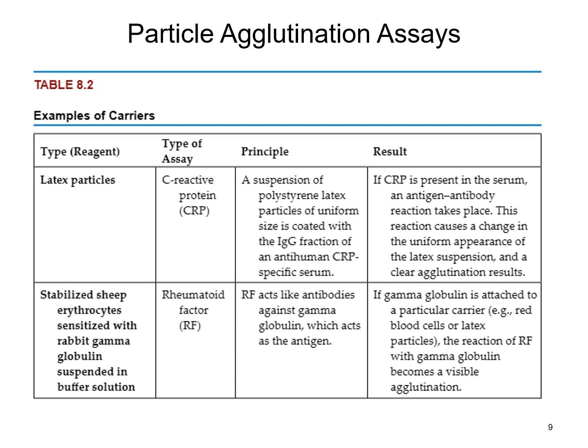Some of them may use charcoal, some of them may use those latex particles. I've seen those latex particles in blue, I've seen them in yellow, I've seen them in white. So you get a variety of manufacturers that use different things, but basically it's using those particles to help enhance the visualization of that reaction taking place.